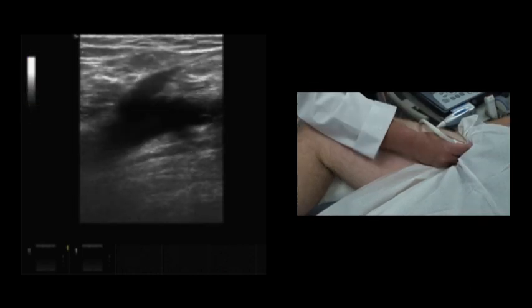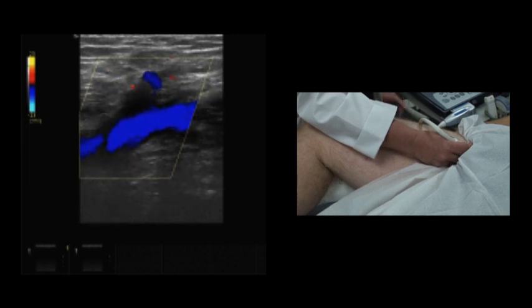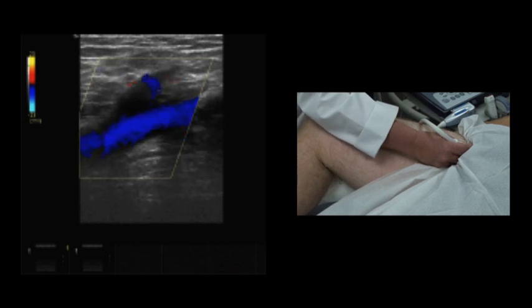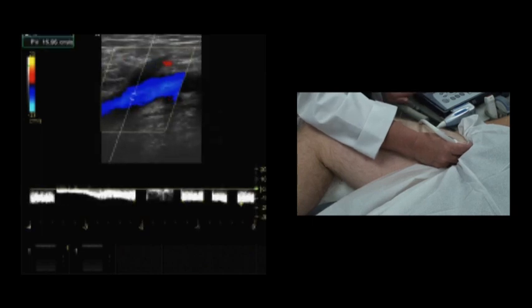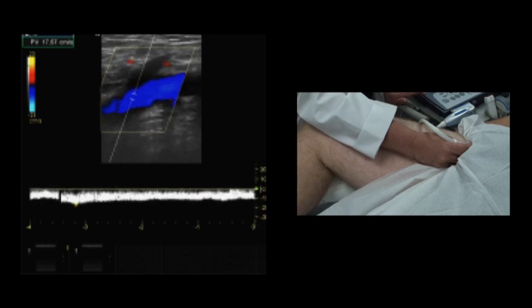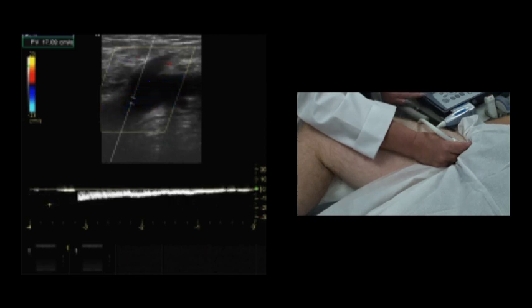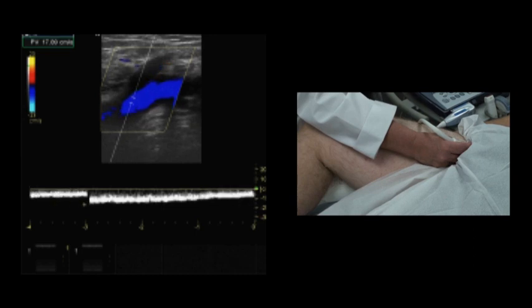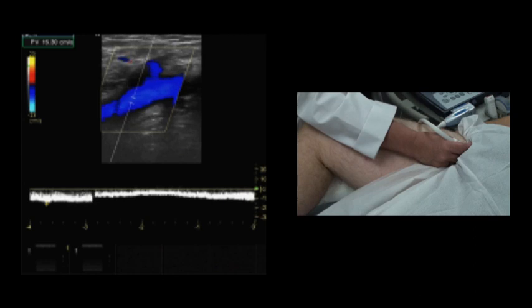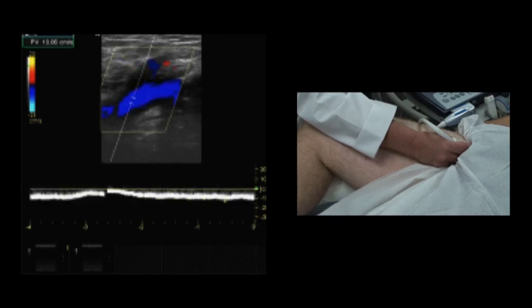We're now going to demonstrate Doppler and color. We're in the common femoral vein. Here we now have the color, noticing the phasicity, and applying Doppler. Note the spectral waveform. It's moving with the respirations. Breathe in and out, please. Okay, very good. We see the decrease as he inhales. And that exhale, please. This is called phasicity, and this is a normal response to a normal venous system. If we run into DVT, this will become continuous. Whether he inhales or exhales will not change the spectrum.